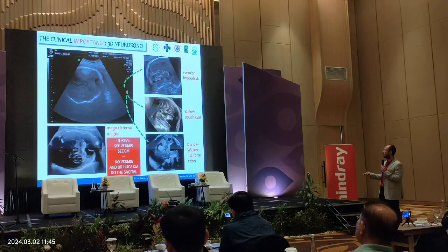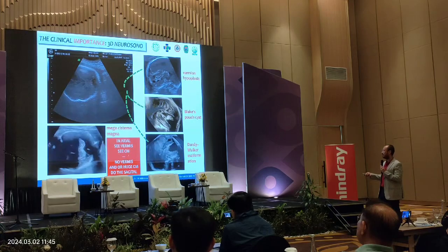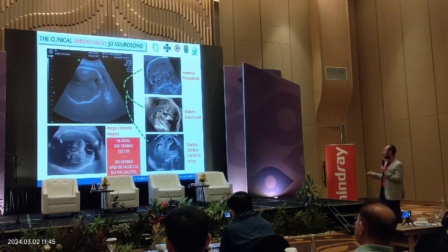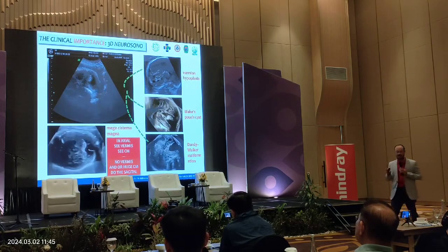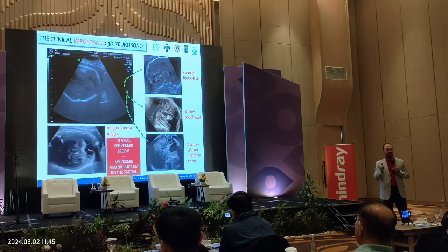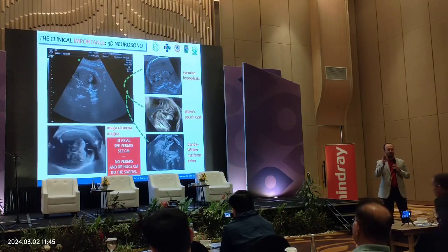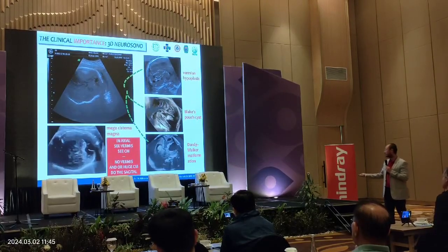So if we see the vermis in axial, and we see a large cisterna magna, maybe this is a mega cisterna magna. Still, we need to find out by examining the sagittal. So, sagittal slicing of the plane is mandatory if we have an abnormality in the posterior fossa.